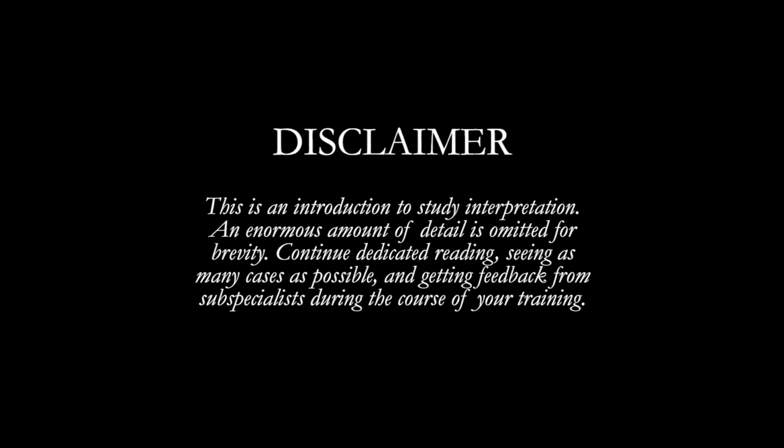Please note that this is an introduction to study interpretation. An enormous amount of detail is omitted for brevity. Continue dedicated reading, seeing as many cases as possible, and keep getting feedback from subspecialists during the course of your training.